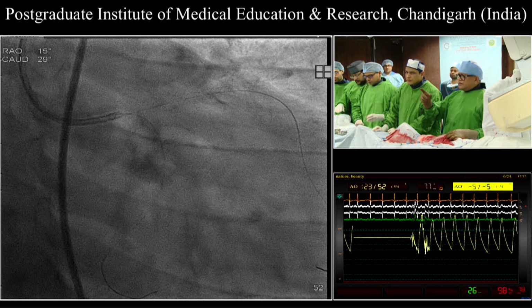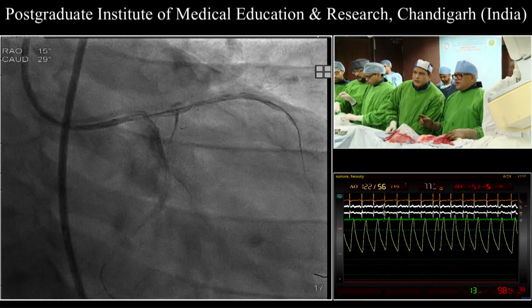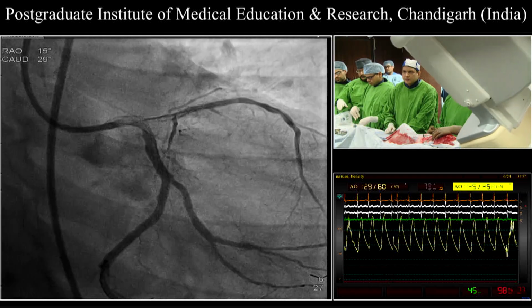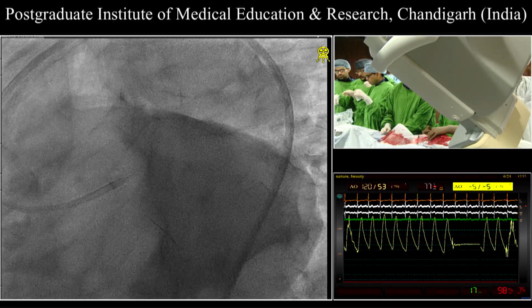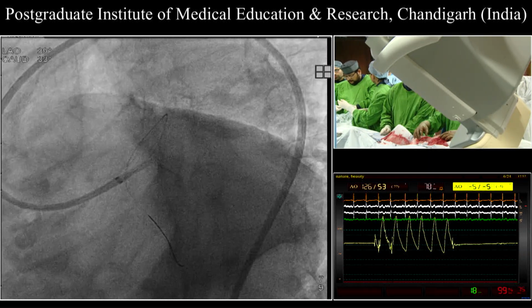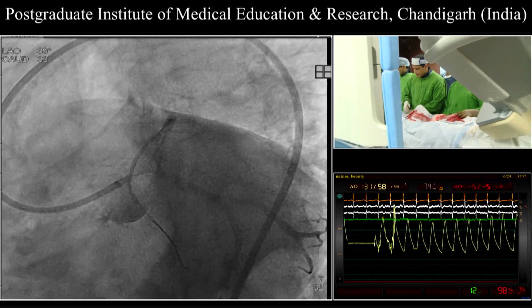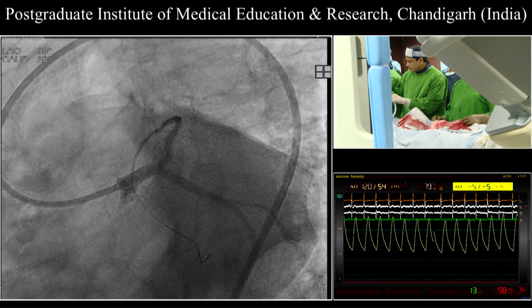Last scene. I think with this disease should we go ostially or left main? Left main too. Can you get the spider view? Spider. We can go to the ostium also, right? This is clear, I think. This is fine. Let's go ahead for the ostium. If required, we can go ahead. So now 333 is fine, I think. Let's go with 333.